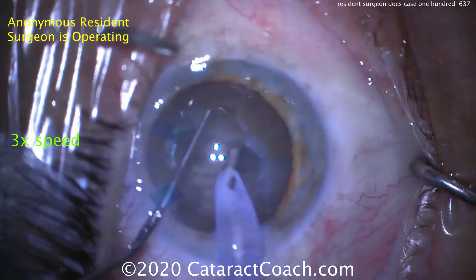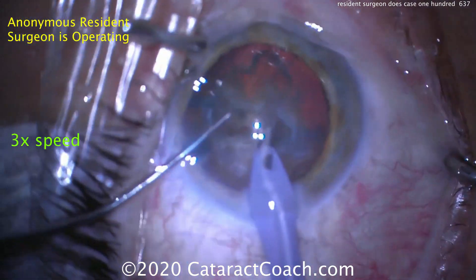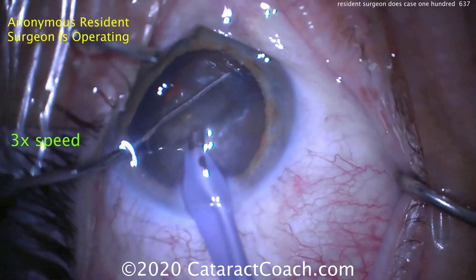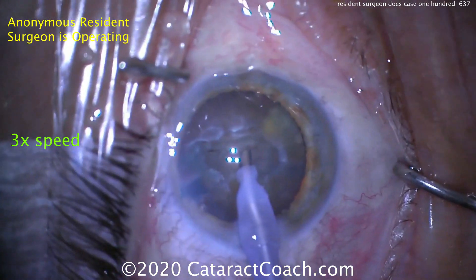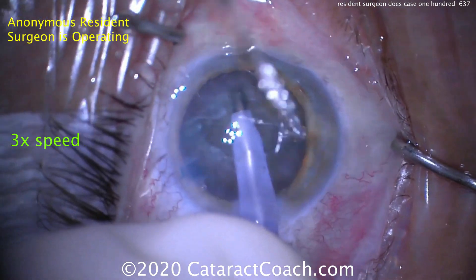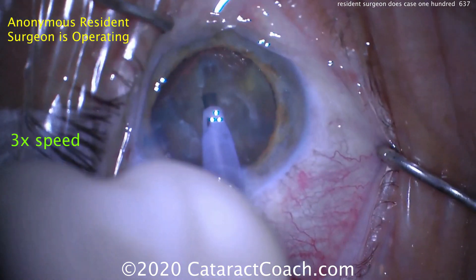Rotating the nucleus around. Let's see what's going to happen now — another groove, or are we going to do a chop? Looks like I'm trying to bring the nuclear piece up — looks like perhaps a stop and chop. The eye is being pushed into the nasal canthal area a little bit; we want to work on that. And another groove — so this looks like a four-quadrant divide and conquer technique. Totally reasonable to do at case 100. This looks great.